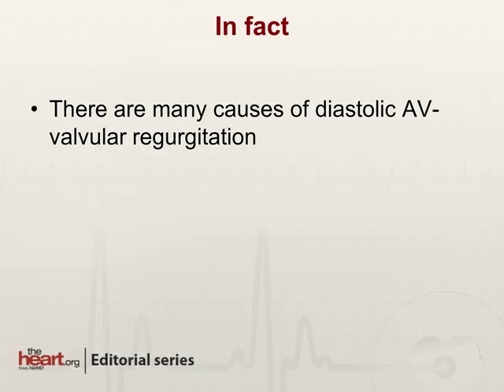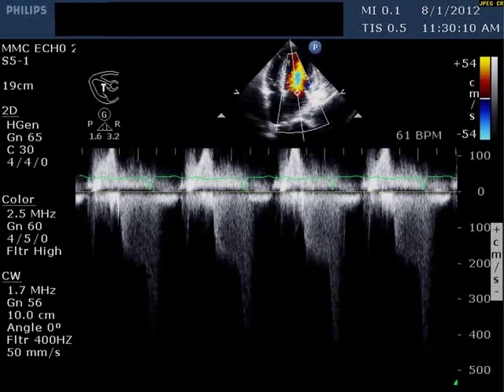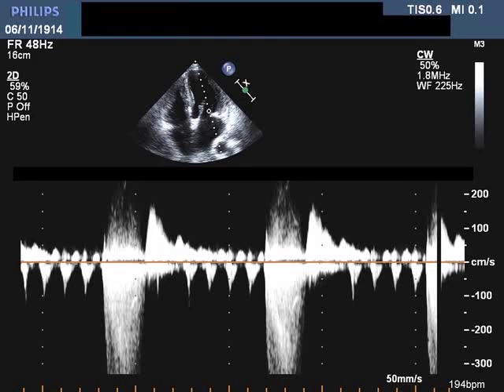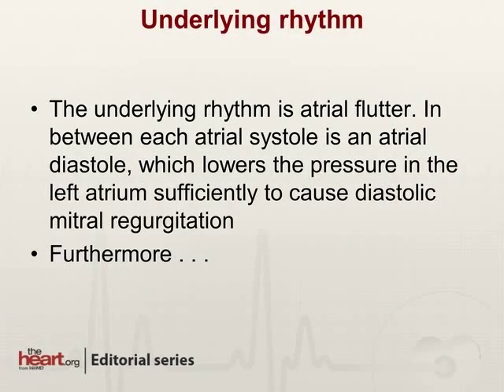So in fact, this patient has diastolic mitral regurgitation, and there are many causes. Here are some examples: this is a patient whose PR interval was almost 400 milliseconds — almost the entire mitral regurgitation jet is in diastole, and the MR is low velocity because it is being driven by atrial relaxation, occurring well before ventricular systole due to the very prolonged AV conduction. This is also an example of diastolic MR seen in patients with atrial flutter — every time there is an atrial systole there is an atrial diastole, so there are lots of tiny diastolic MR jets in between the systolic MRs.